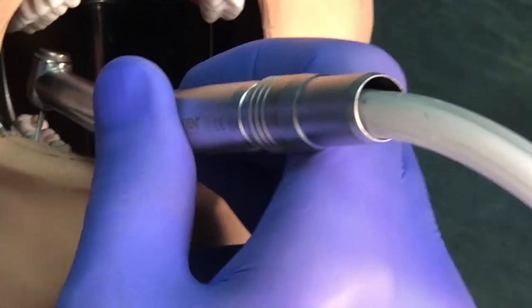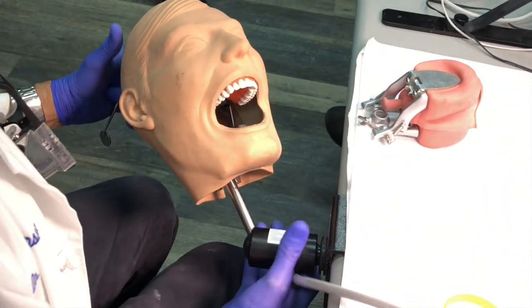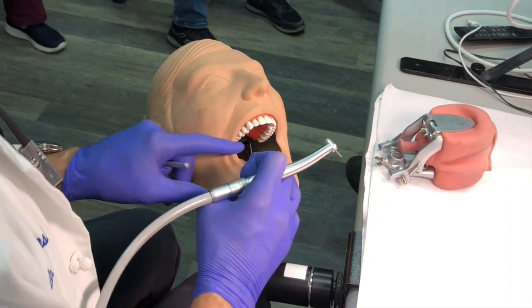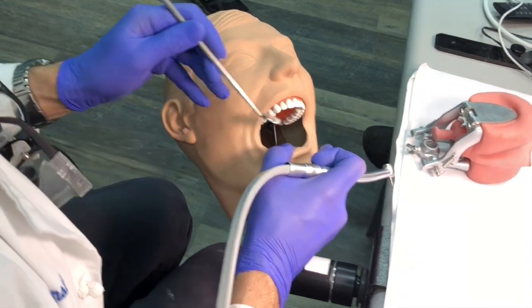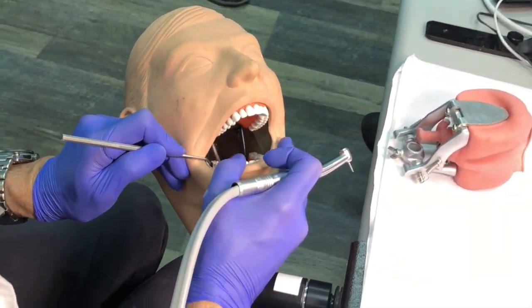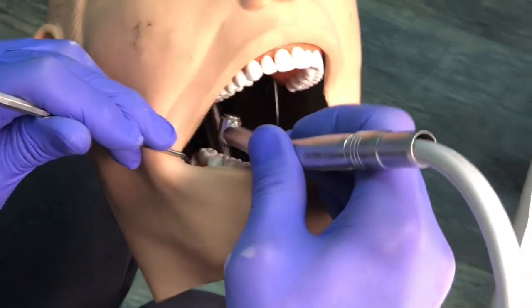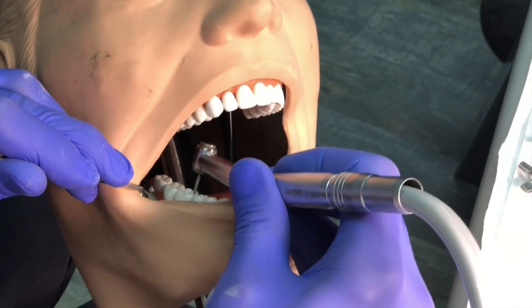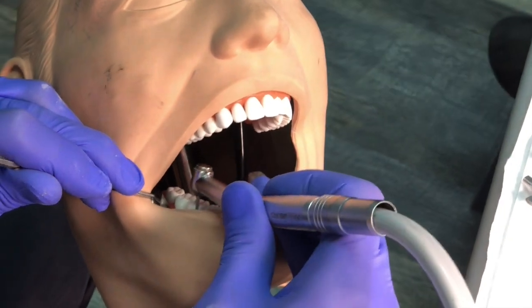Once I have as much lingual view as I can get, I can move to the nine o'clock position. Have the patient tip just 30 degrees — not 45, just a little bit — and you have a significant advantage. Now I retract with the mirror, use the handpiece with a finger rest, and do the buccal and interproximal using direct vision. It's amazing — I can access the second molar and even the third molar like this.